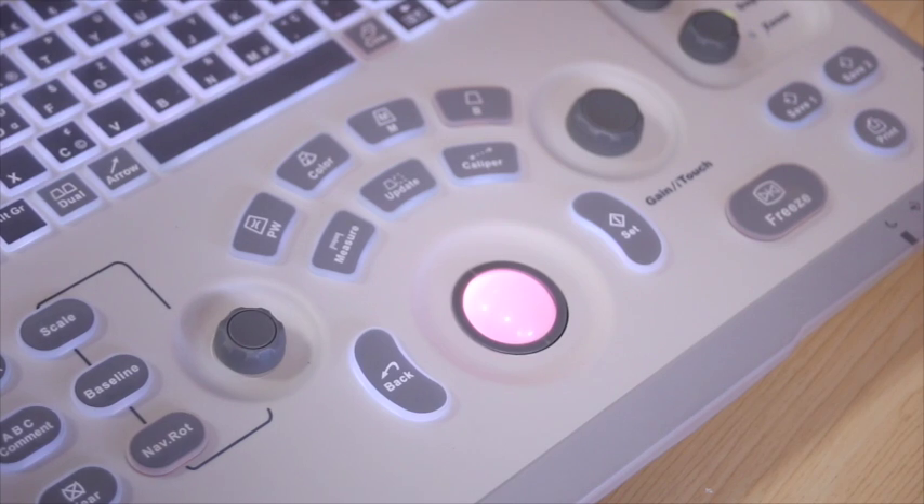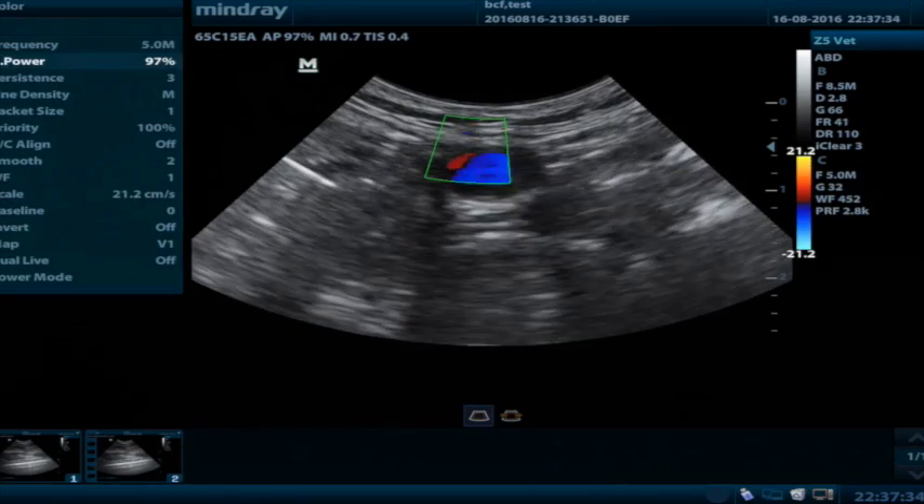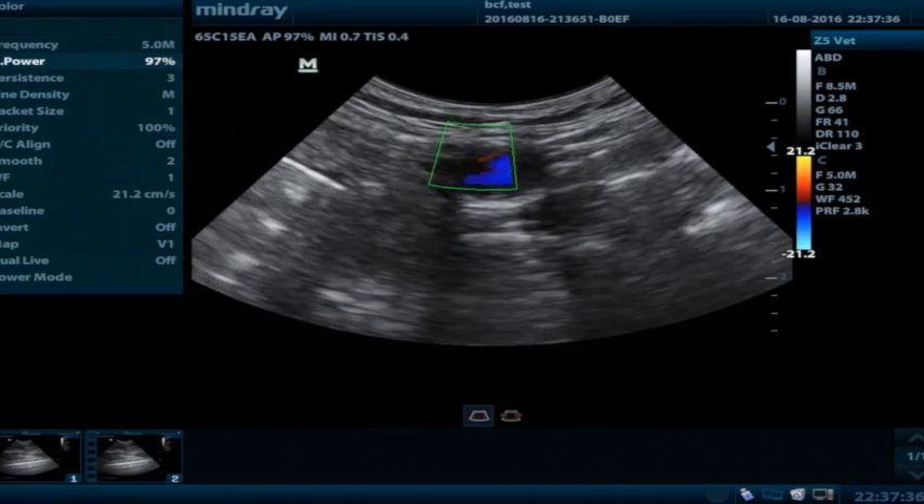Before you start doing any kind of colour Doppler, you need to make sure that your B-mode image is optimal. You need to ensure that your depth is correct, that you have the right frequency, and that your focal points are positioned where you need to be. That's because once you push the colour Doppler button, your colour Doppler box appears, but now your gain and your frequency are about the colour Doppler box, not your B-mode image.